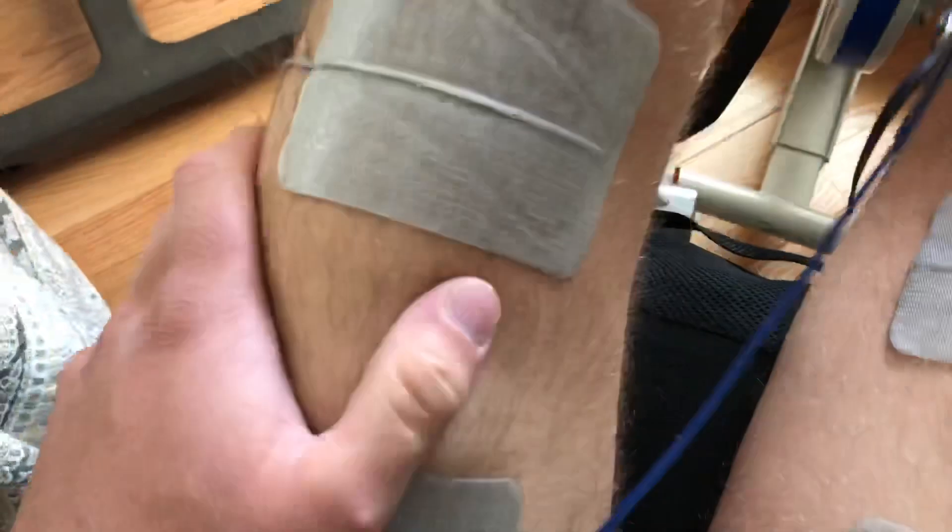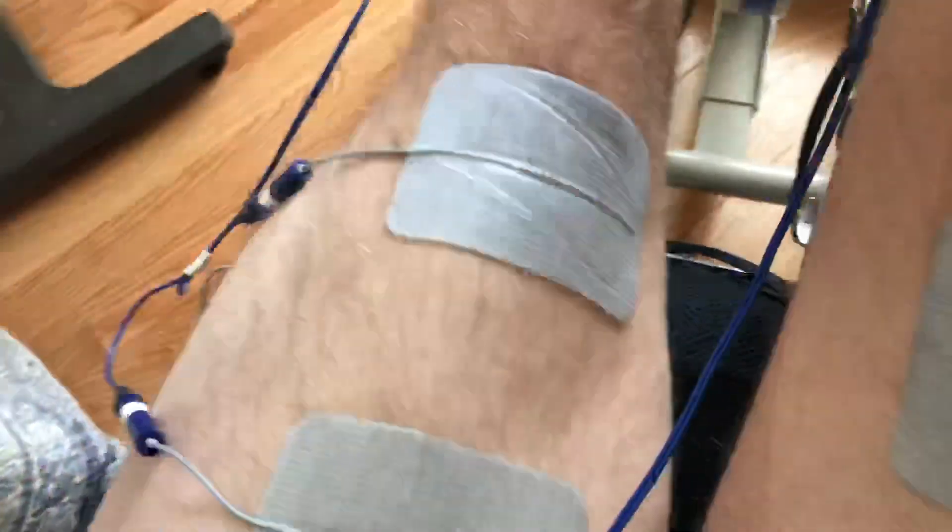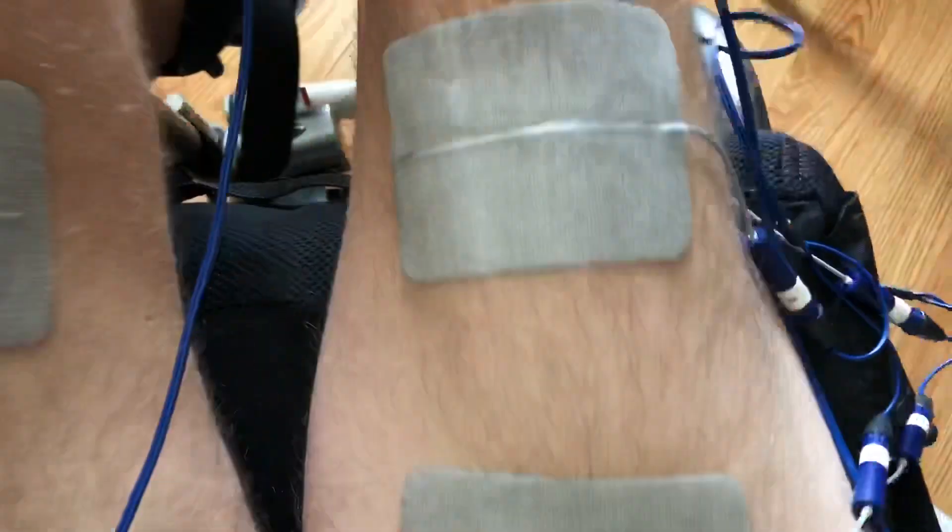I can feel the muscles contracting. I'm not sure if you can see it that well, but they are contracting. I just had a ham sandwich and some mac and cheese, so I have some energy in me. I'm going to go into the exoskeleton and go for a walk now.